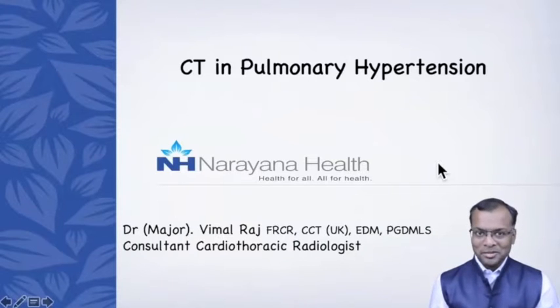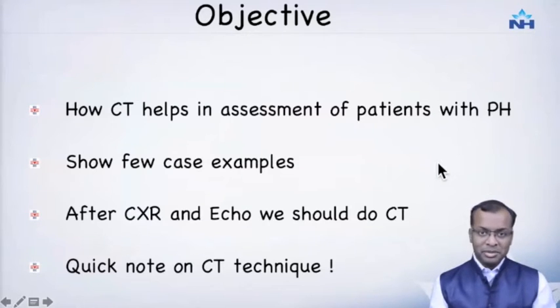Today I'm going to be talking to you about the role of CT in assessment of patients with pulmonary hypertension. My objectives are very simple. I'm going to tell you about how CT helps in assessment of patients with pulmonary hypertension. I'm going to share a few case examples and show how this works.